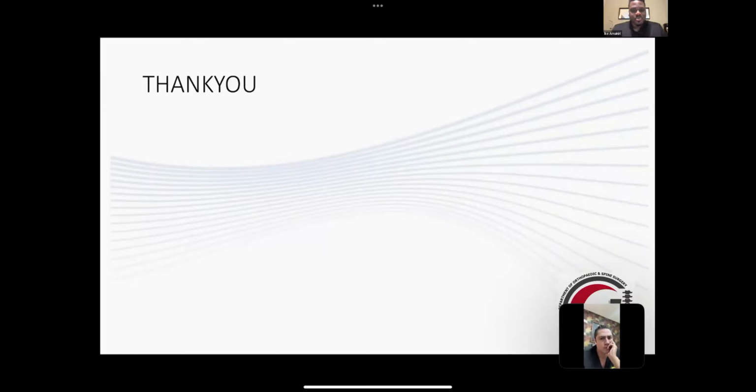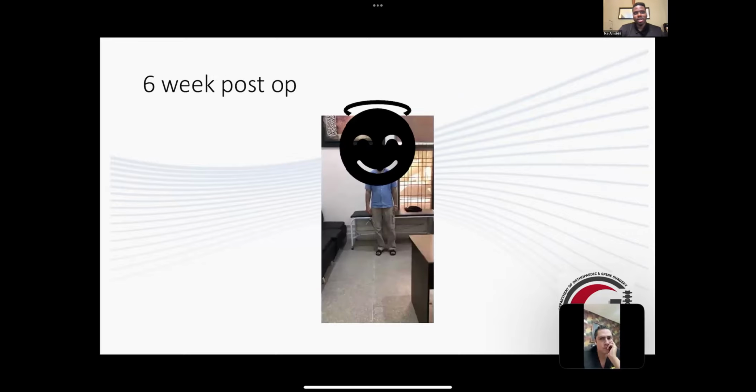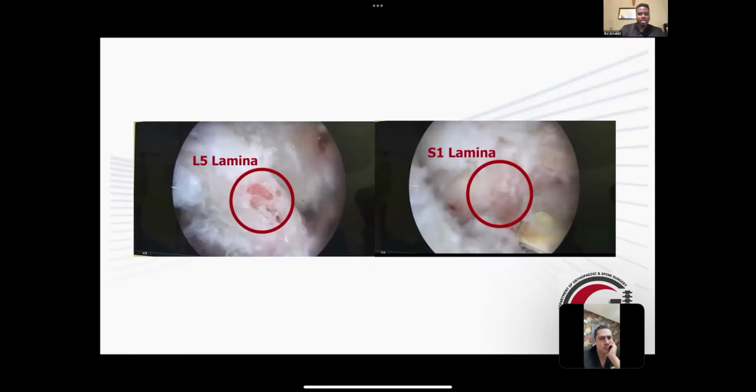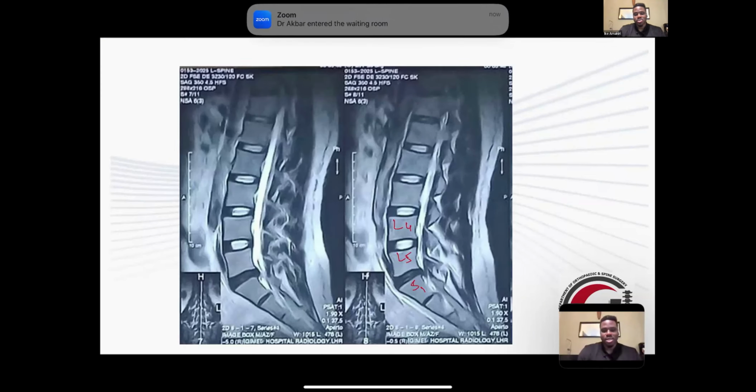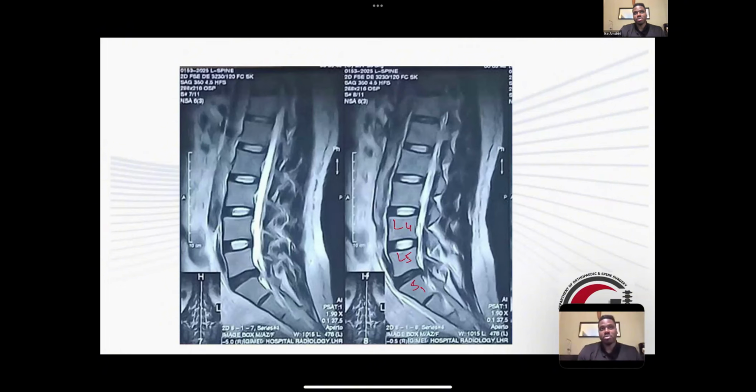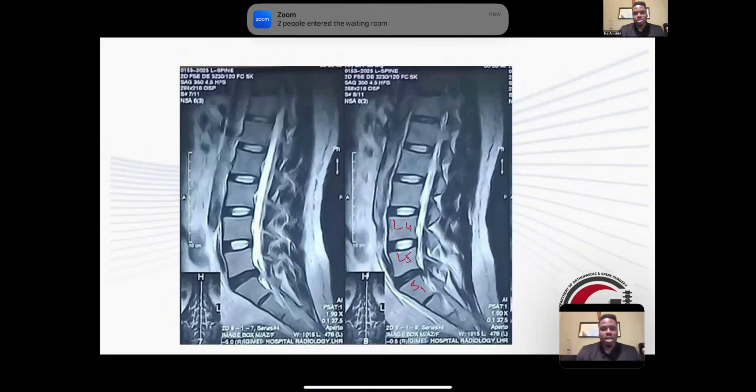Thank you, Dr. Zubair. If you could go back to the pre-op MRIs. Again, a similar question here. You used the interlaminar technique, and I wanted to gauge the crowd, starting with Dr. Rizwan again. Do you believe the interlaminar technique was the way to go here, or is it also possible to decompress and perform this procedure transforaminally, and what limitations guide you in one direction or the other?